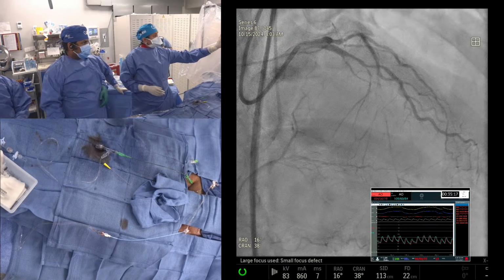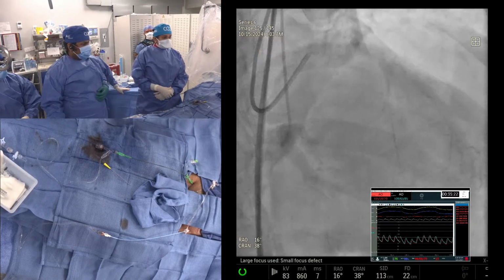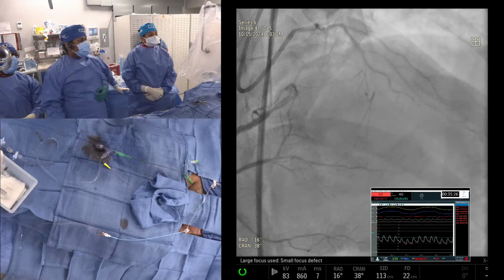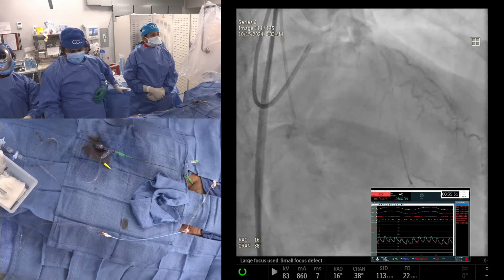And after that, if you need your next wire, people may want Gaia, which could be okay, but I would go with Miracle. Clearly, this here does not look like calcium. The earlier angiogram appeared to show it, but there's no calcium here. Okay, we go to click present.